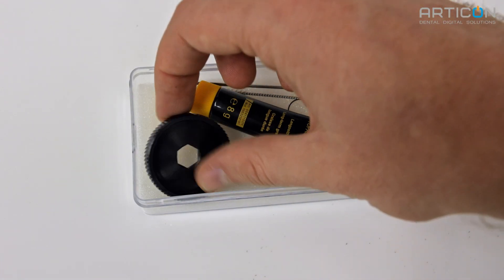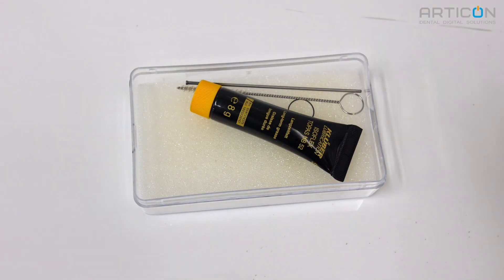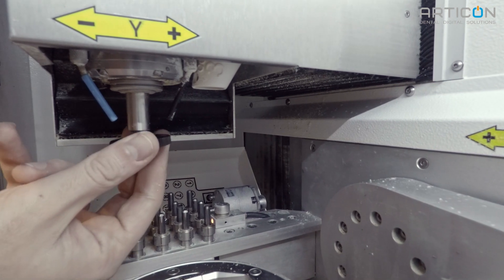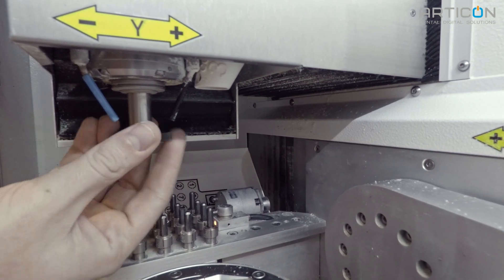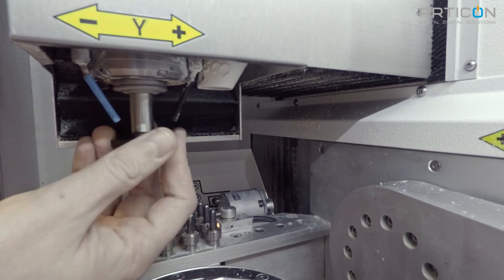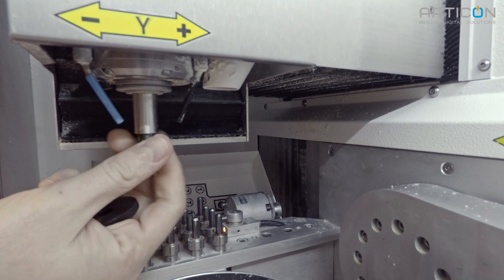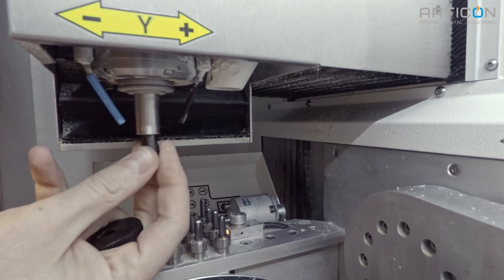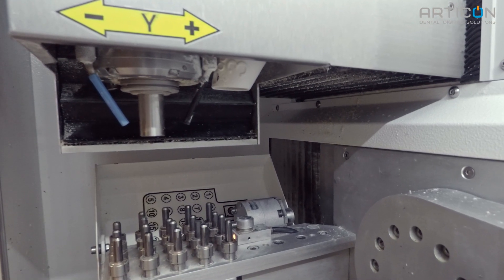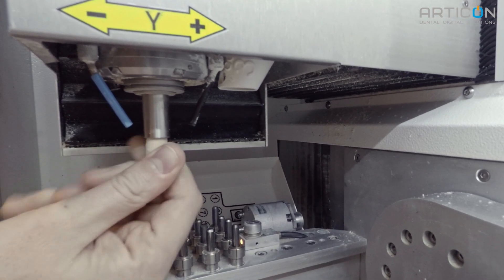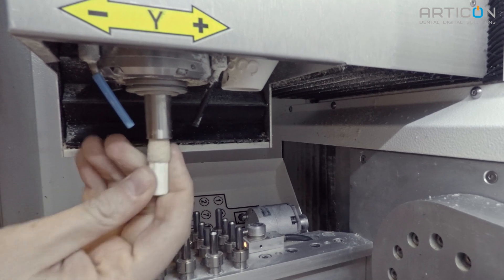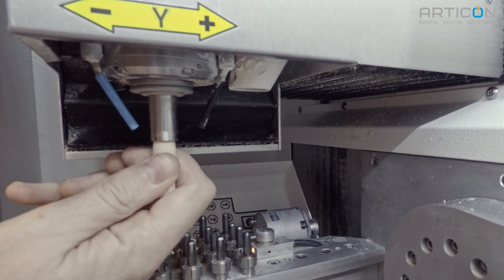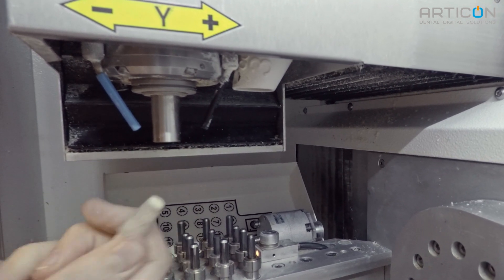Using the collet removal tool from the maintenance kit, unscrew the collet chuck from the shaft. Take the felt cone and insert it into the spindle shaft and make a few turns to clean the shaft inside.